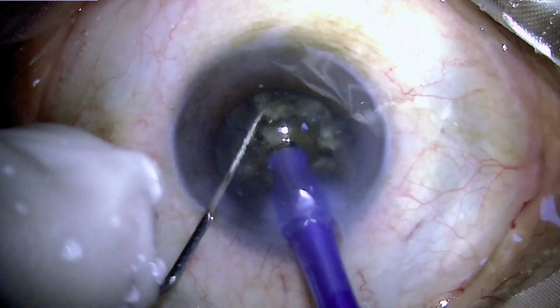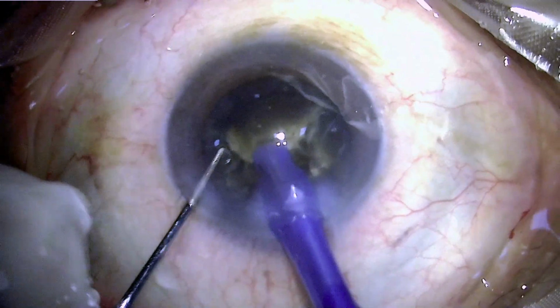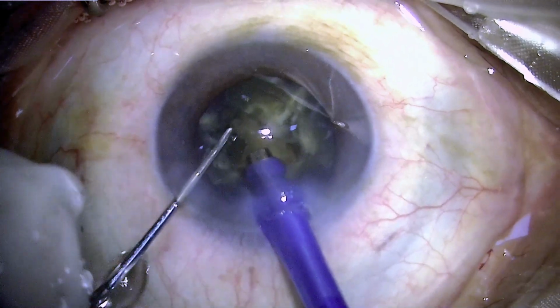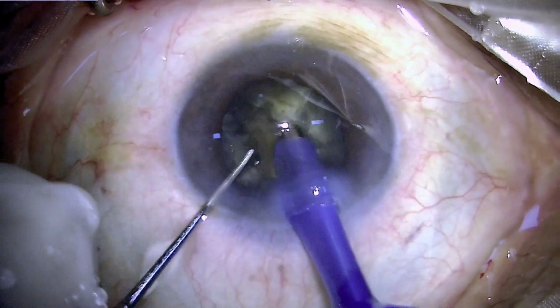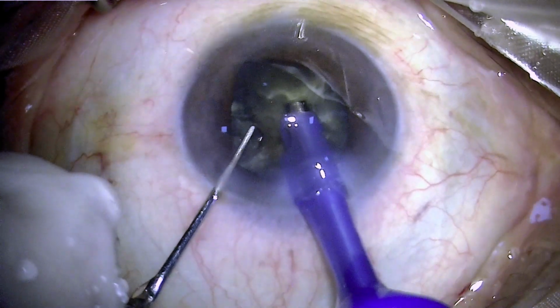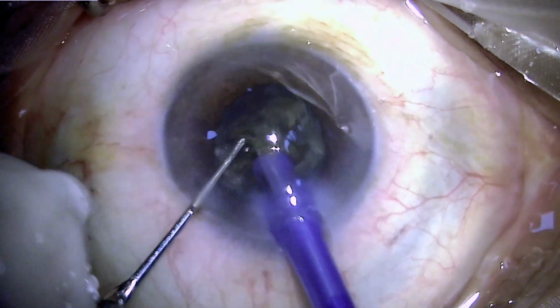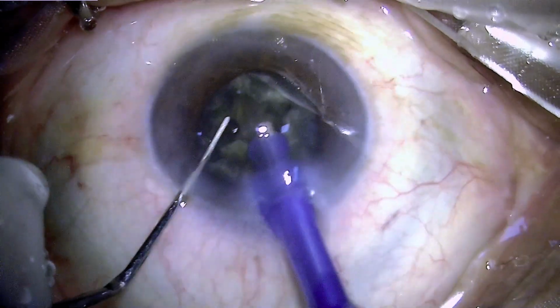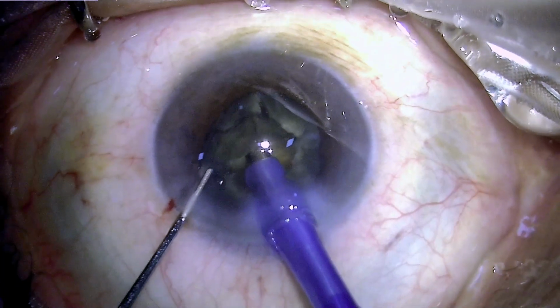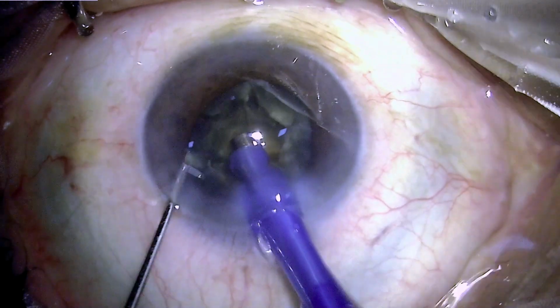But then at some point of time, one of my staff members who had actually seen such a situation earlier when we had made a similar video where there was a kink in the IV line and this was causing a surge, decided to check the tubing, and when he was checking the tubing, he found that this time the kink was at another point. So he asked me that he will change the tubing, and so I stopped the surgery.